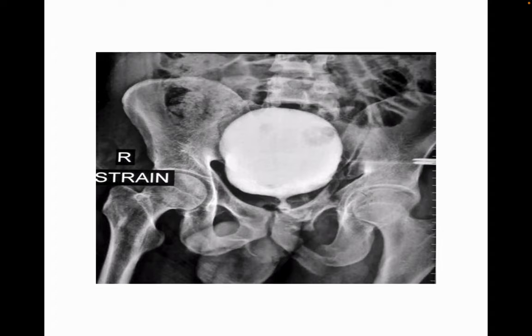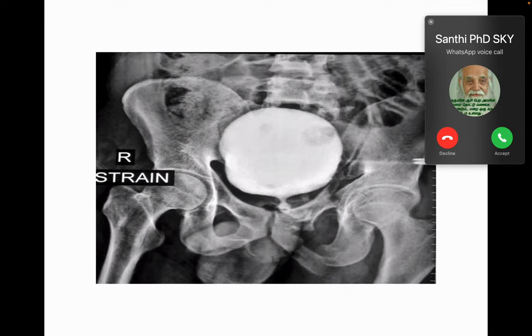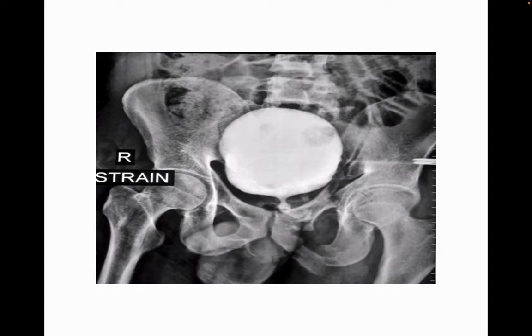It looks as though the contrast is getting cut off at the top end of the prostate — literally at the base of the prostate, not at the apex. The prostatic urethra is normally two to three centimeters long, and we are only seeing a little bit of it. Are we looking at a very serious injury? Or is it just an artifact because this fellow has not been able to void adequately? You should attempt once again to encourage him to void better.